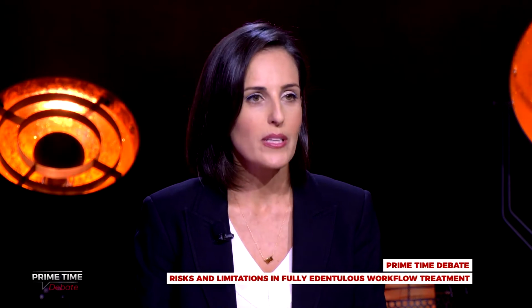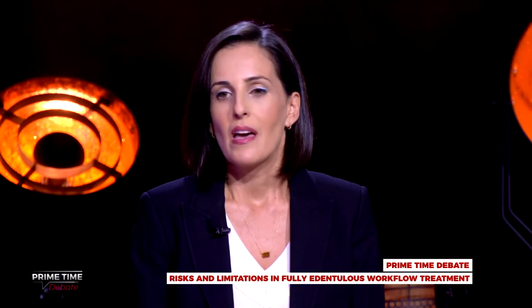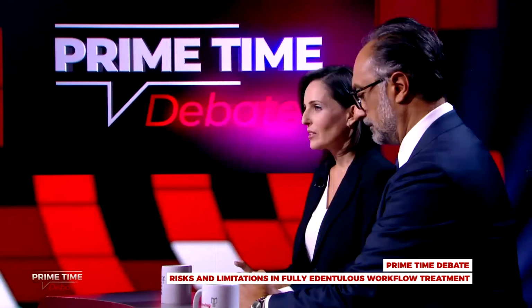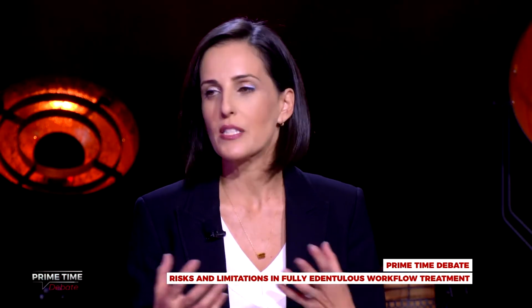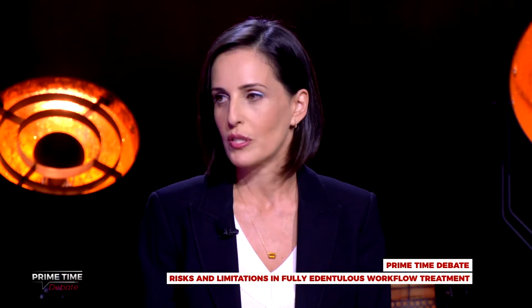Now, most of the digital tools that we have are facing the same challenges. We are working in a physical environment, in the mouth of the patient. And once we are using the digital tools, we need to go into a software. But to get into the software, we need to transform the information from the patient's mouth reliably onto the software.